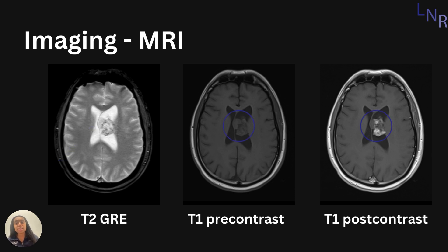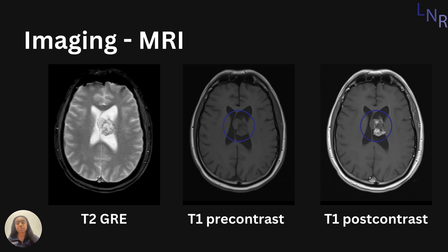T1 is used to show the anatomy of the brain and structures clearly, which is helpful to identify normal versus abnormal anatomy. In this example, we see a T1 pre-contrast versus a T1 post-contrast, which illuminates the pathology of the central neurocytoma, again pushing against that septum pellicidum.